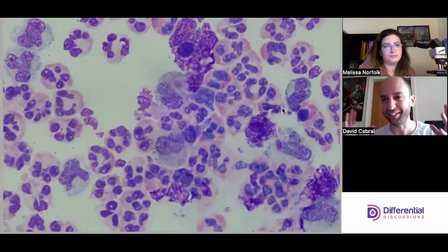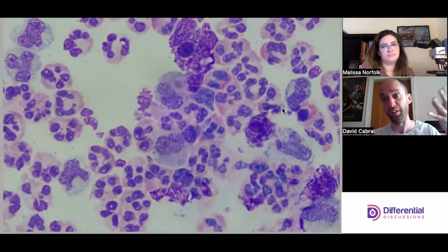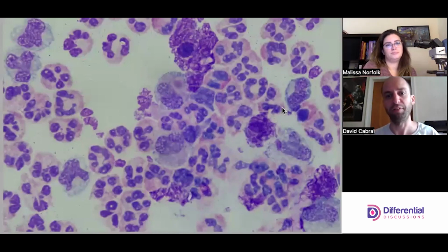I usually hate schistocytes. I am the anti-schistocyte guy, right? It is very important with body fluids. These cells are in a place they're not supposed to be, right? The cell turnover ratio is very, very high. These cells are going to die, degenerate. And so you'll get nuclei or nuclear material that's just kind of blobs, and you'll see all sorts of stuff like that. If you can't positively identify the features of the cell, don't call it.